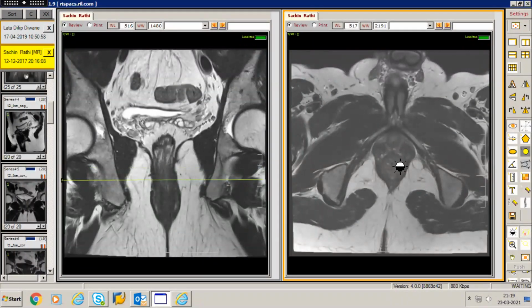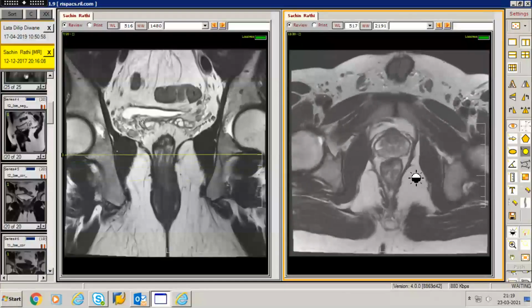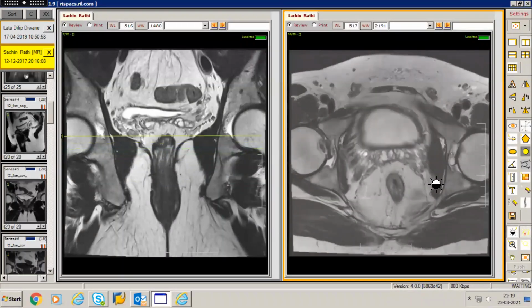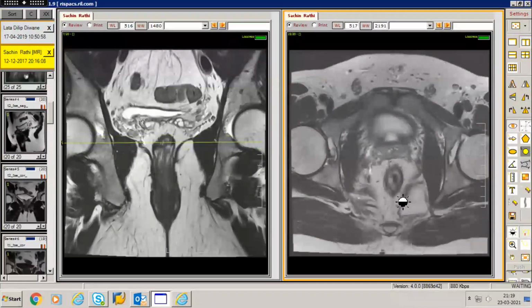Of course, I will not be talking much about those structures for this particular session. The lateral boundaries, obviously, as you are familiar with, would be the obturator internus muscle over here. And coming again to the parts of the levator ani in the axial images, the most important for us would be the iliococcygeus. So this would be the iliococcygeus muscle fibers extending over here.